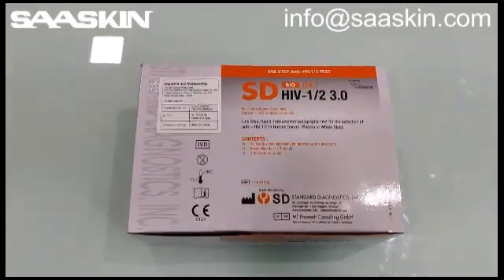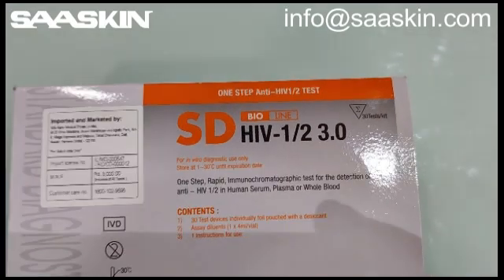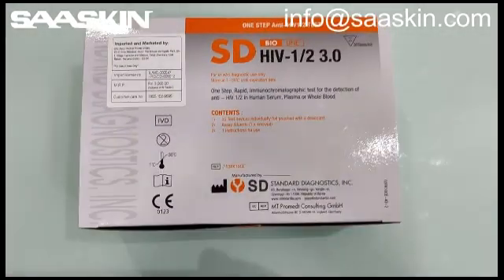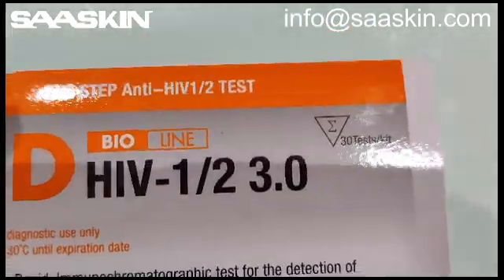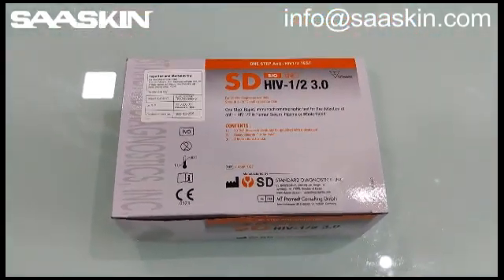Today we're going to see an unboxing of SD Bioline HIV 1/2 antibody test kit. This is a test box of 30 tests. Here I'm quickly going to introduce this box and also going to unbox this for you.